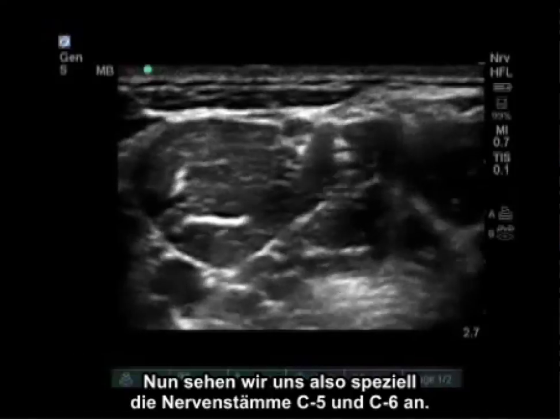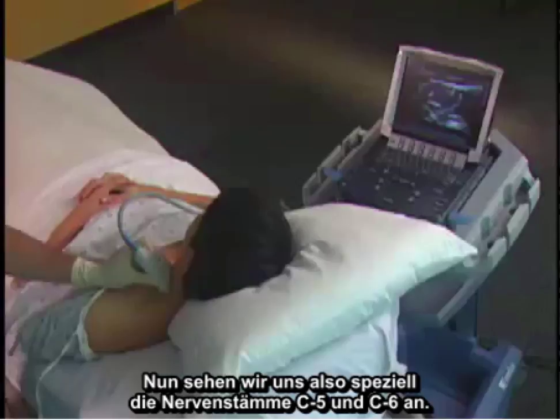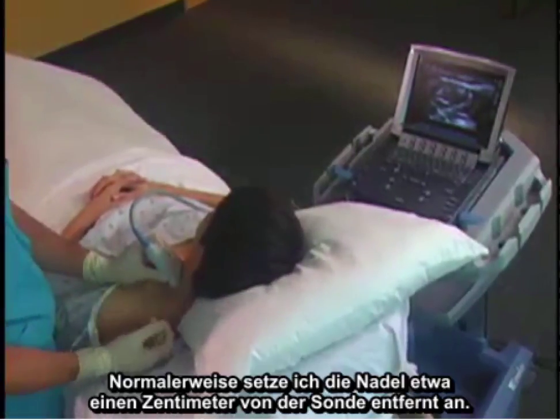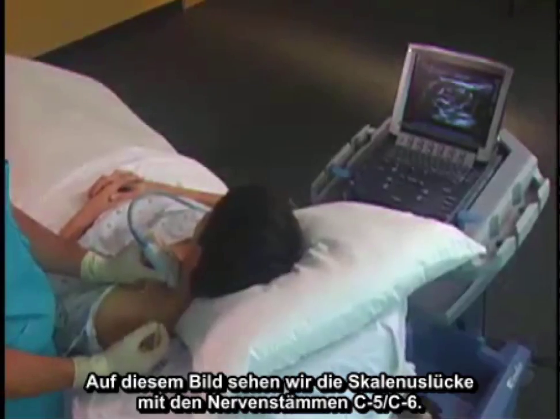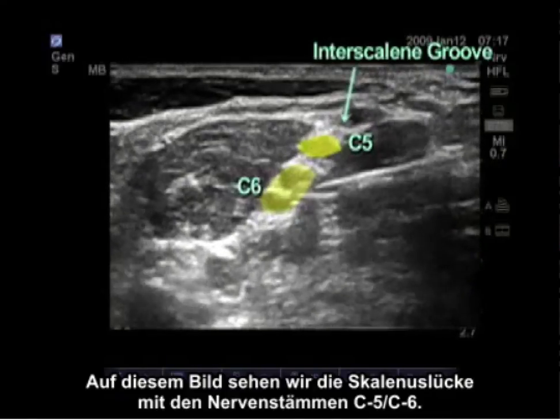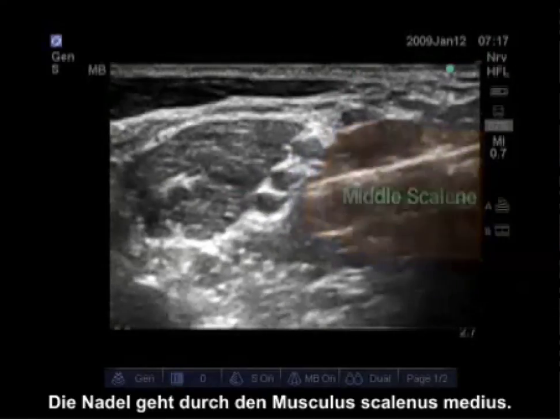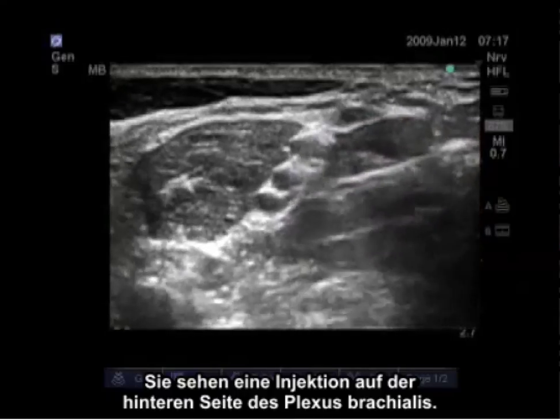Now we are looking specifically at the C5 and C6 nerve roots. Our needle approach comes from posterior; I usually start the needle approximately one centimeter away from the probe. In this image we see the interscalene groove with the C5 and C6 nerve roots. The needle is passing through the middle scalene muscle.